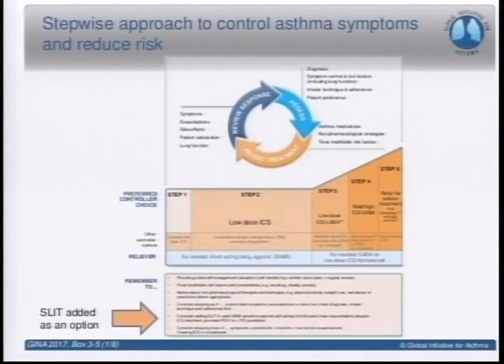Personally, most of the thermoplasties that I have done have been in people with pretty bad obstructive lung disease, because those are the patients that usually get referred for this type of therapy. But if you look at the strict eligibility criteria, you're supposed to have an FEV1 of over 60%, and there's a number of other things, so most of the very severe people were excluded from these trials. Arguably, maybe the people who would have the most benefit.